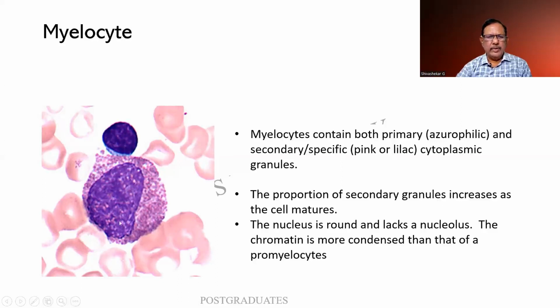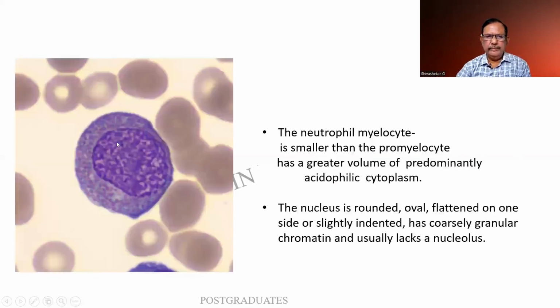And look at this myelocyte. The main thing I would like you to appreciate is that one edge of it appears almost flat and is pushed towards the edge of the cell, and it has granules. The nucleolus is not very clear. So it is important: the only cell which will have clear nucleoli as well as the granules will be the promyelocyte.